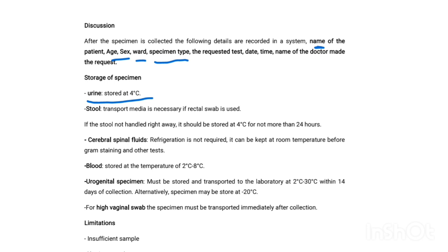Then stool: there must be a transport media where stool is put. For example, a rectal swab has a transport media in the same swab in which it is transported. And stool shouldn't be stored for more than 24 hours.